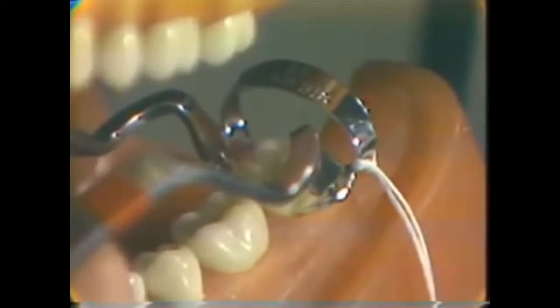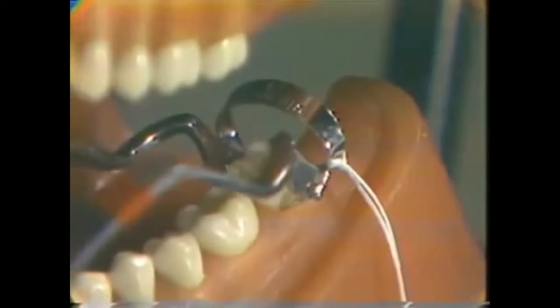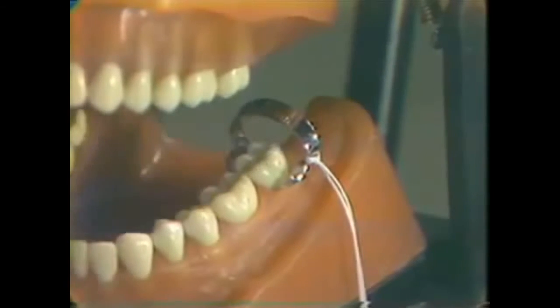When the clamp is in position, the forceps is slowly released until the clamp engages the tooth firmly with the 4-point contact provided by the curvature of the jaws. And then the forceps will be removed. Now, looking closely again at the 4-point contact as the clamp engages the tooth, noting that there is no contact of the clamp with the tooth in the area of the center of the jaw, but that each of the points, 2 on the lingual and 2 on the buccal, engage the tooth so that the clamp has stability and will remain in place throughout the isolation of this case.